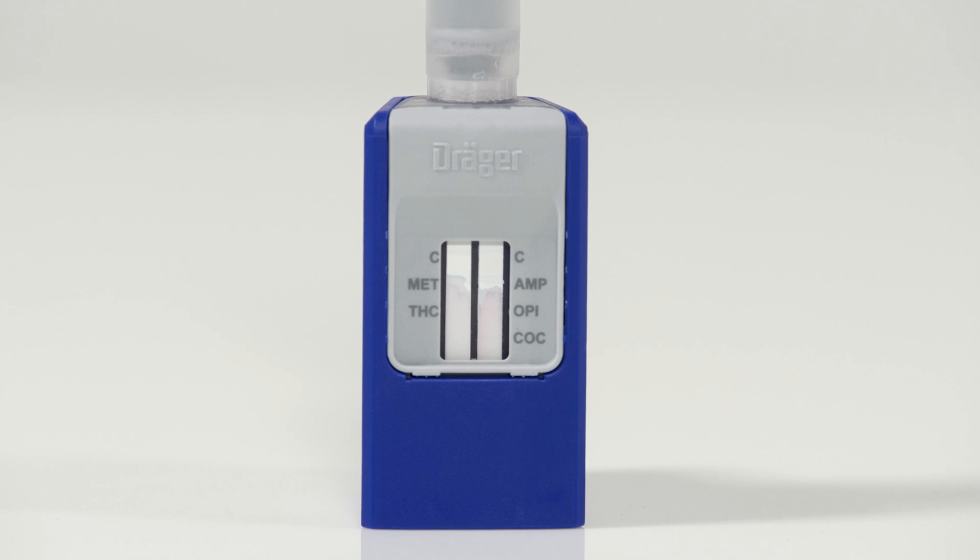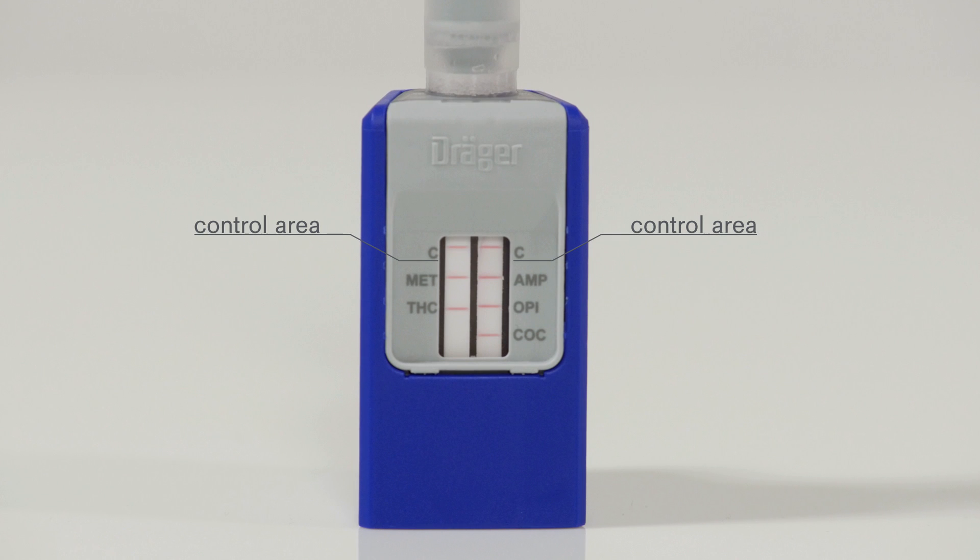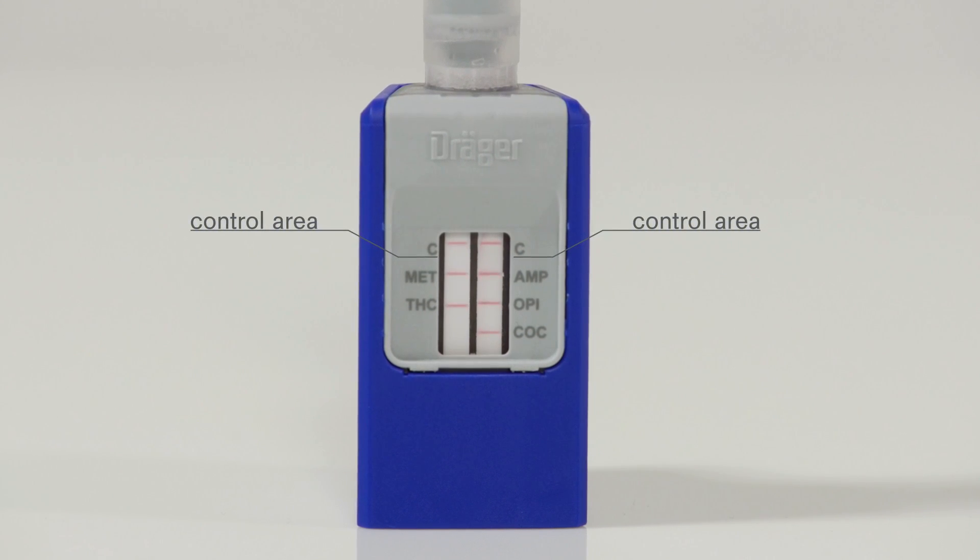The control and test lines appear after around 2 to 3 minutes. You can then read off the results. If red lines appear in the viewing window — in the upper control area labelled with C, and in the area below it showing the substances to be tested — then the test is valid and negative. This means none of the five substances have been identified.